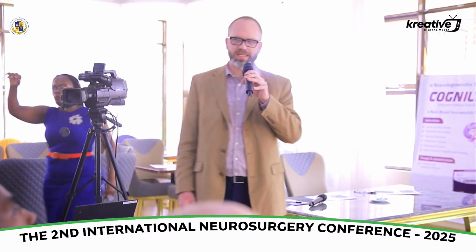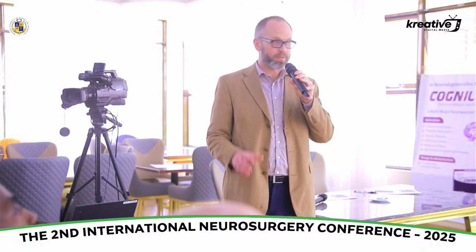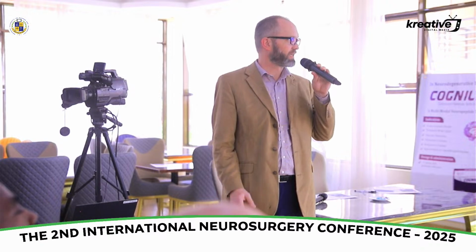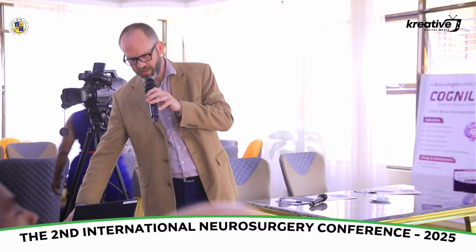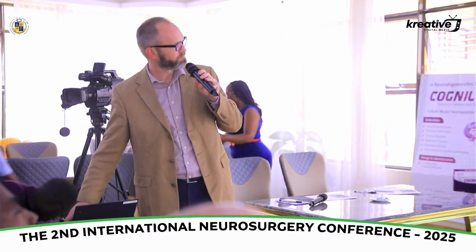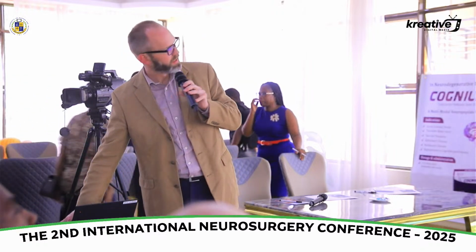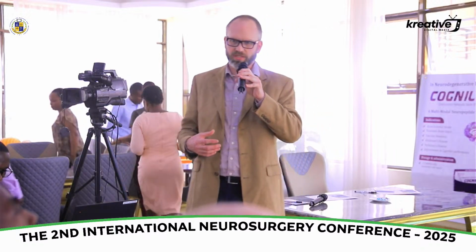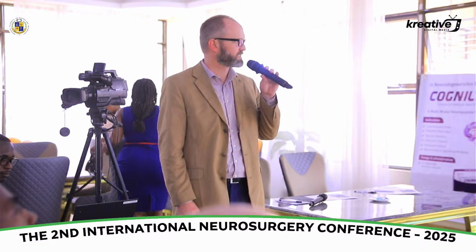If we go to C mode, this uses data and range of depth from the A mode and transitions to B mode to examine the whole region at a depth originally employed in the 2D imagery. Also, it's used more in cardiac surgery. Same with M mode, which gives a time factor. And Doppler comes back to being relevant to neurosurgery. So this looks at blood vessels and flow, including flow velocities.